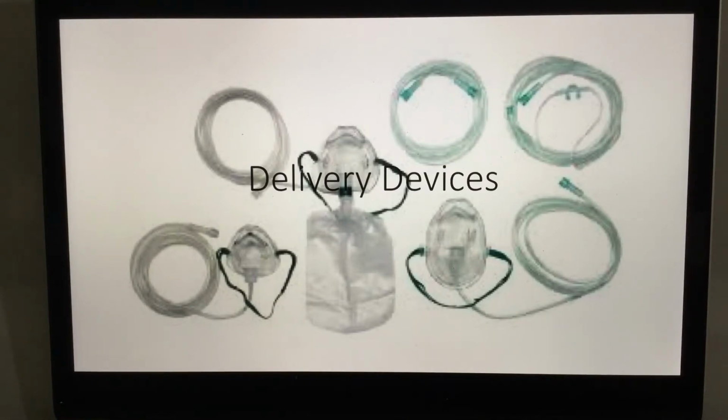This passive flow device regulates the amount of oxygen and percentage of oxygen being delivered to a patient. We would usually start off at 1 liter per minute to the maximum of 6 liters. Anything more than 6 liters is highly irritating to the nostril and nose. Again, the limit is 6 liters and below.